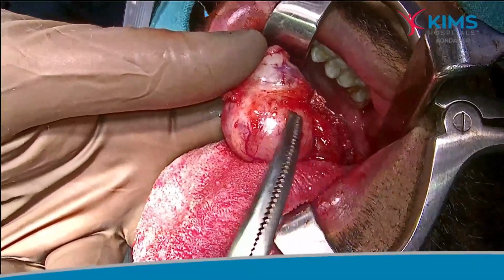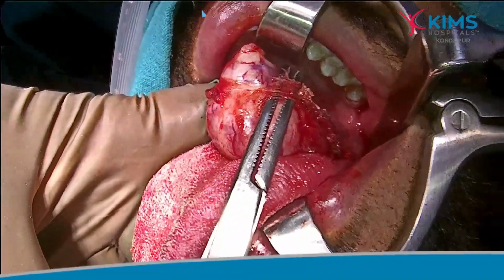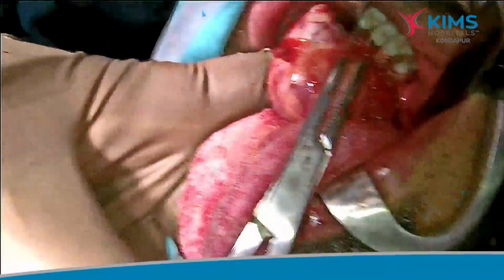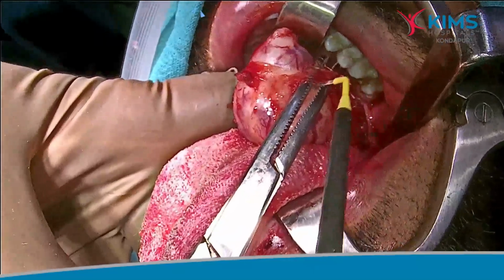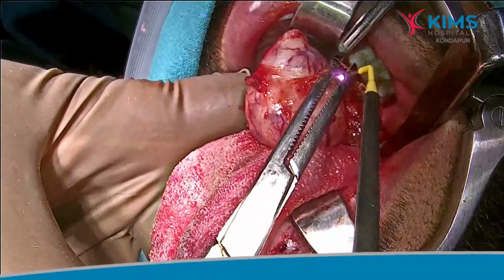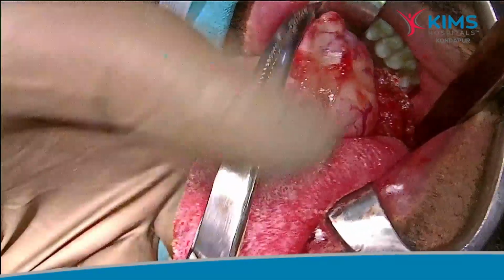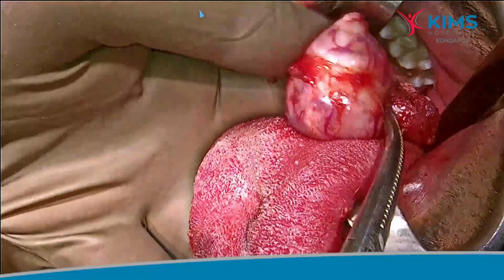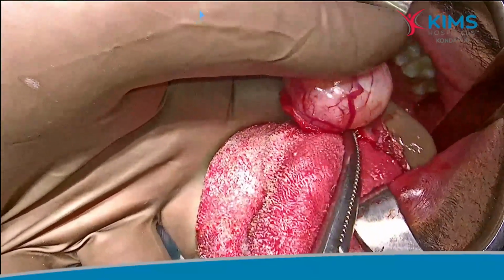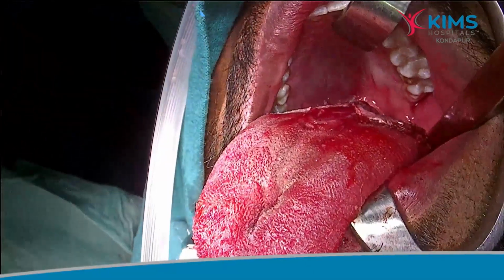Yes, that is the plane of dissection again, using an OT forceps. The radiofrequency needle is used to cut the last holding strand of the superficial flap, and the flap is separated without any damage to it. The tumor is completely removed in total.